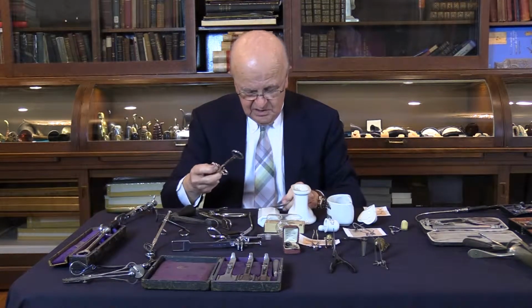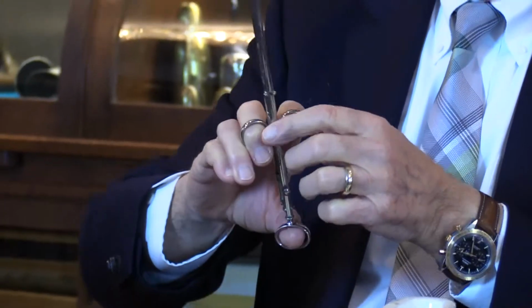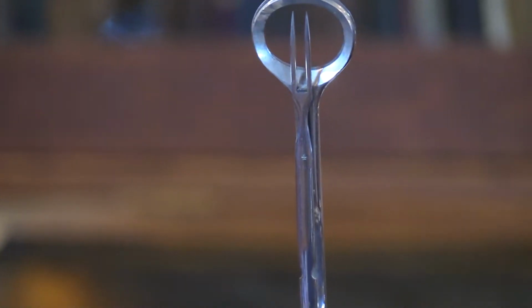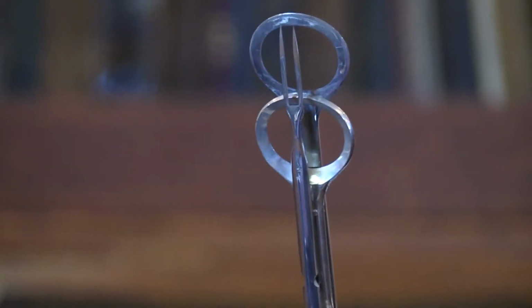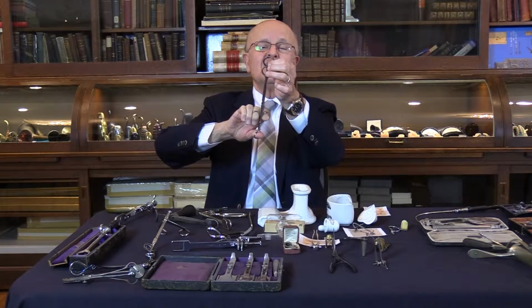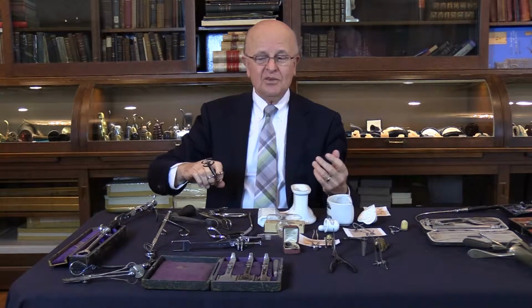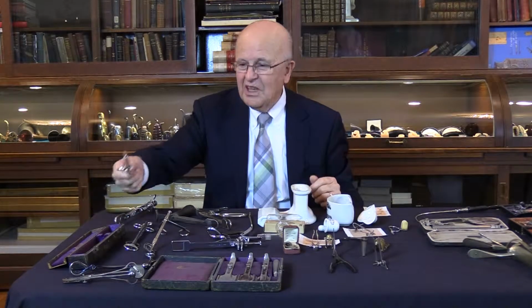And this here is the Mathieu, M-A-T-H-I-E-U guillotine. What it does is, when you put the tonsil through this opening, the first thing that happens is this fork goes through the tonsil, and then you keep pushing, and the tonsil will be cut off and held by these two spears, so to speak, and you can remove it and avoid having the patient swallow his or her own tonsil. They came in different forms.